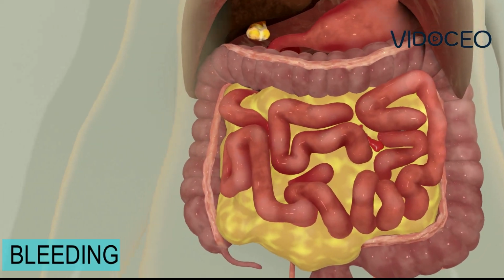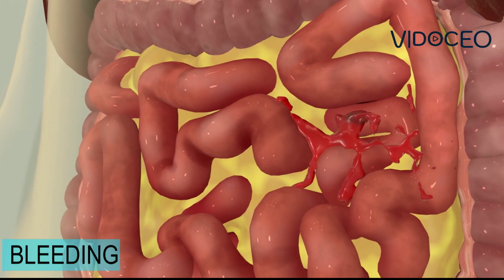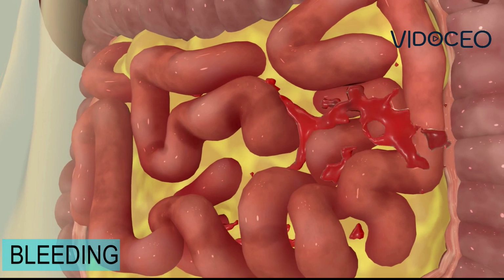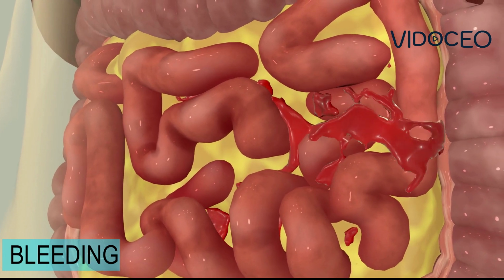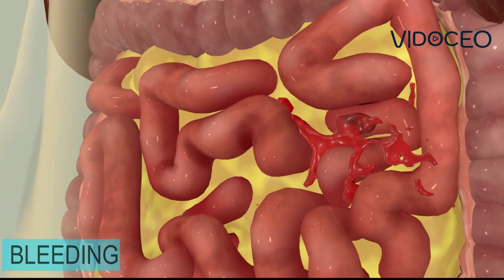In abdominal surgery, bleeding can occur during or after the surgery. The bowel has blood vessels flowing to and from it, carried within the fatty tissue connected to the bowel. While surgeons employ meticulous techniques, such as cauterization or sutures, to minimize this risk, bleeding is an inherent possibility with any intra-abdominal operation. If there is a large amount of bleeding, the patient may need repeat surgery or blood transfusion.